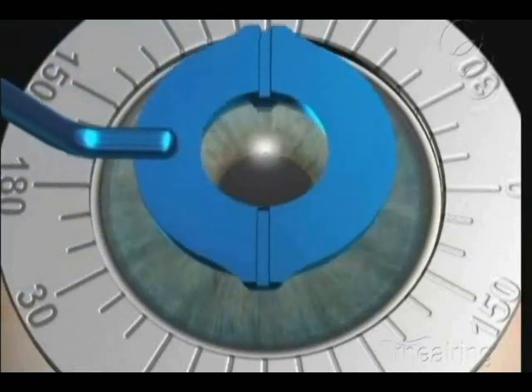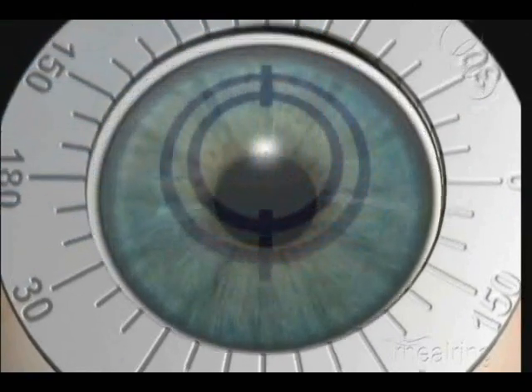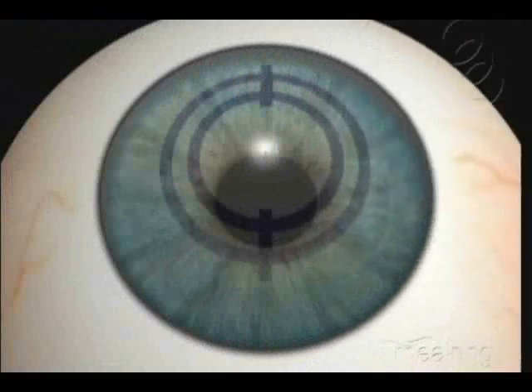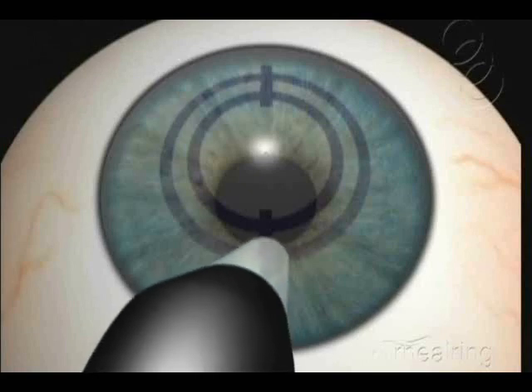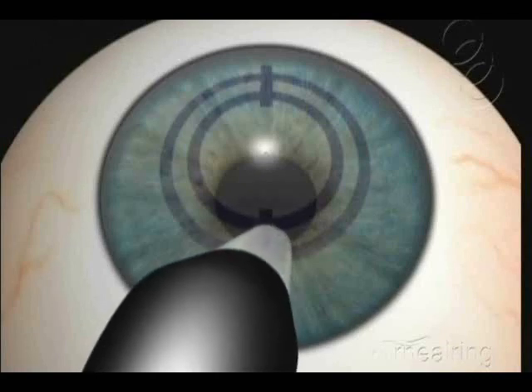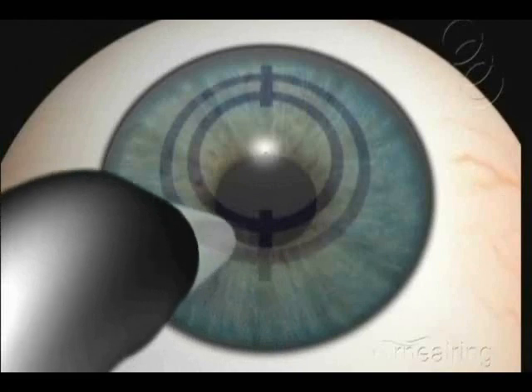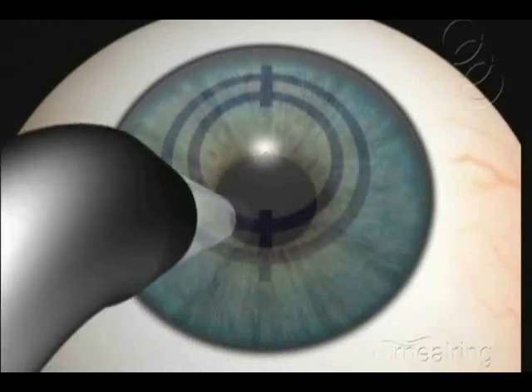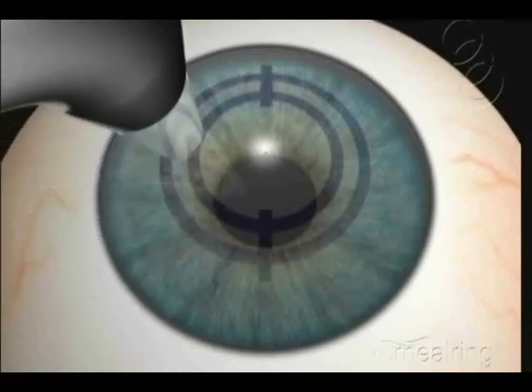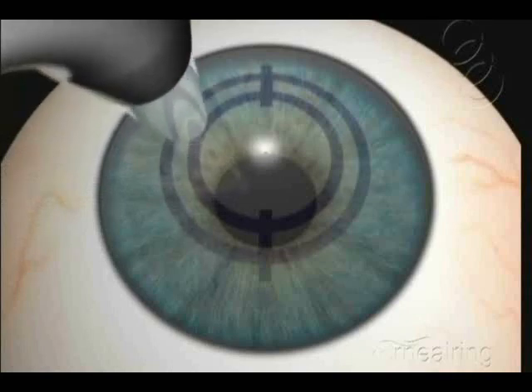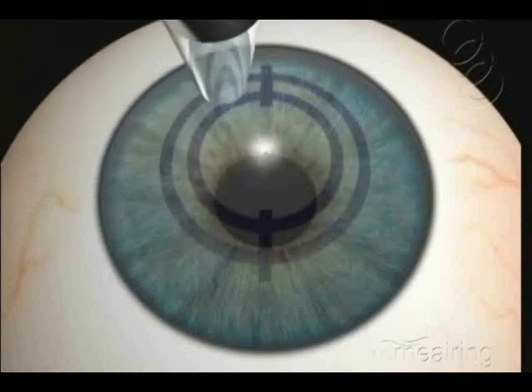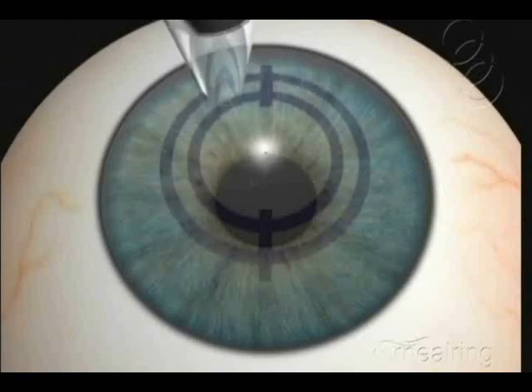Center the double marker at the de-epithelialized spot created in the first step. Use a pachymeter to measure the corneal thickness at the incision site at least three times and consider the mean value. Also, it is important to measure corneal thickness throughout the segment insertion zone to verify if there is any thinness which would contraindicate surgery.